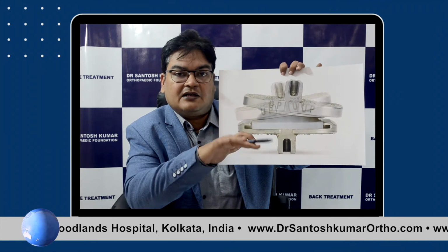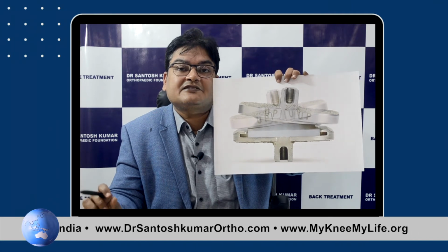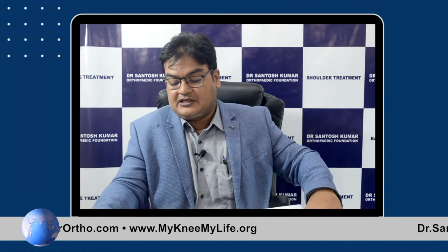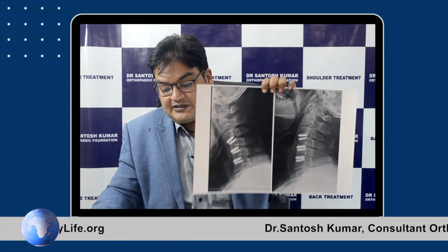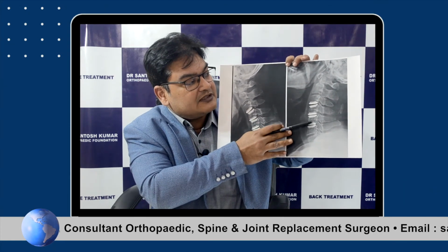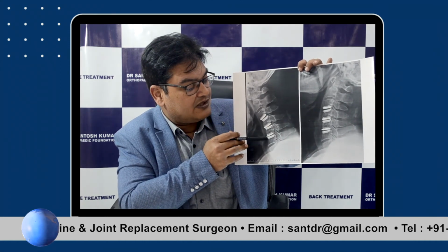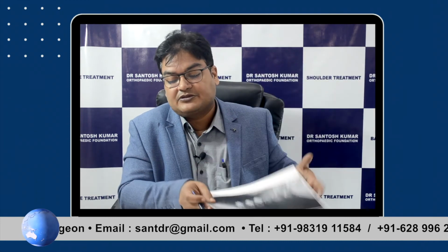So multiple level movement takes place as compared to fusion, wherein the disc space is fused. Here also multiple level movements are taking place. In X-ray we can see that this disc replacement is allowing the movement to take place. Like here the person is looking upwards, so it has allowed the movement to take place. Here the person is looking downwards, so the disc has adjusted according to that. It allows the various level movements to take place.